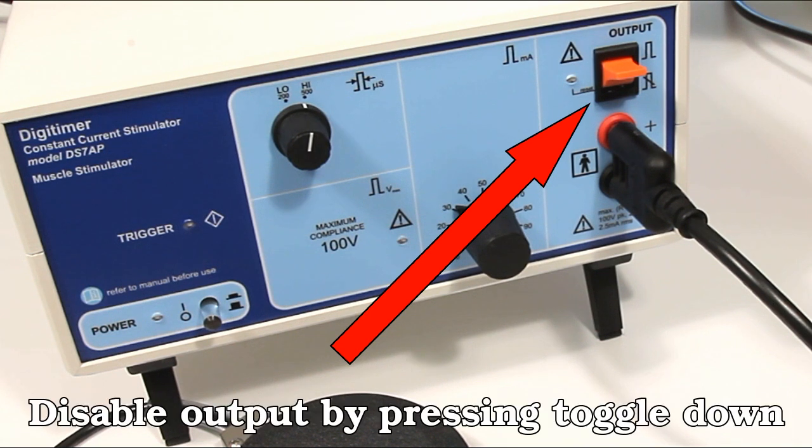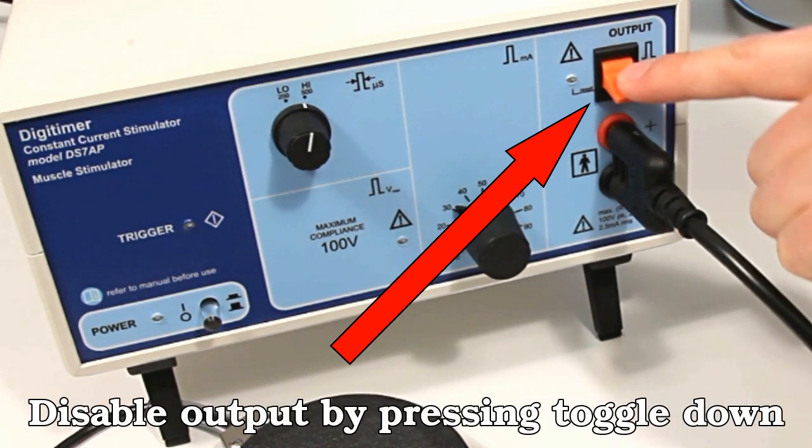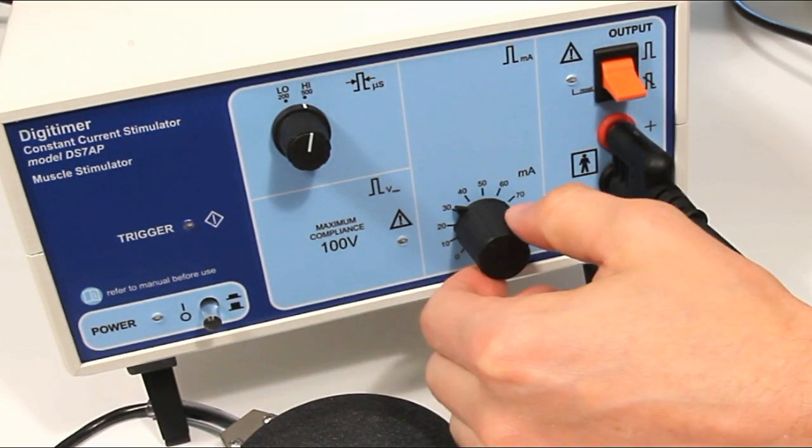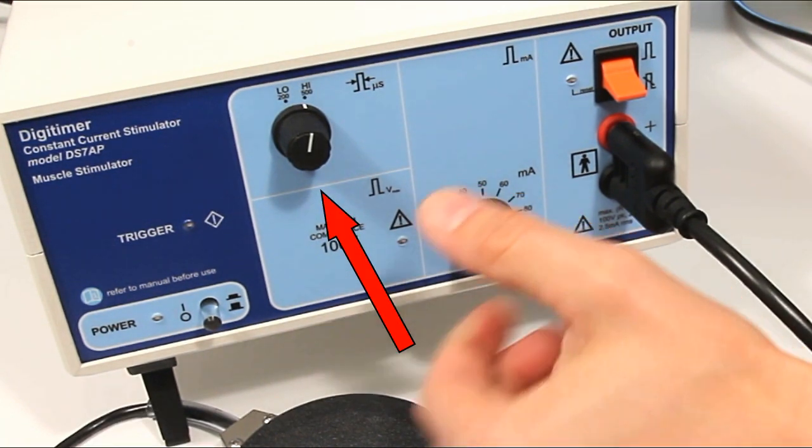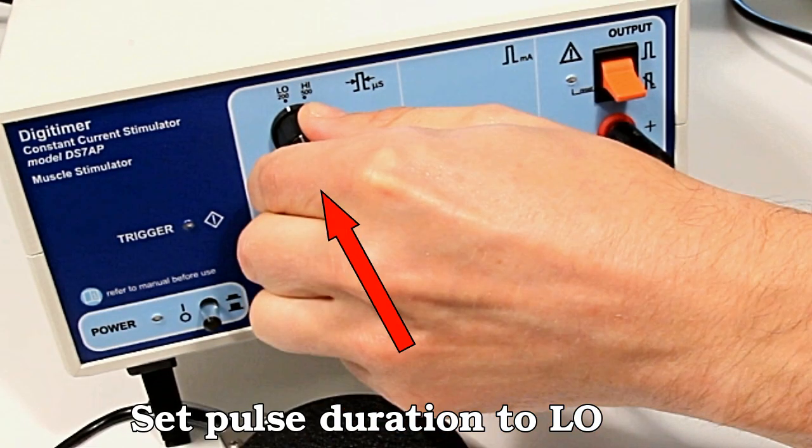Before proceeding, make sure that the orange output enable toggle switch is pushed downwards to disable the stimulator output. Set the current amplitude dial to 0 and pulse duration switch to low.